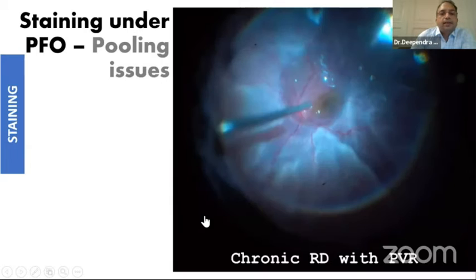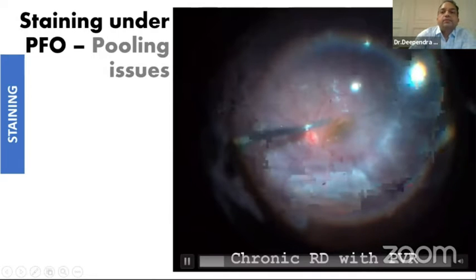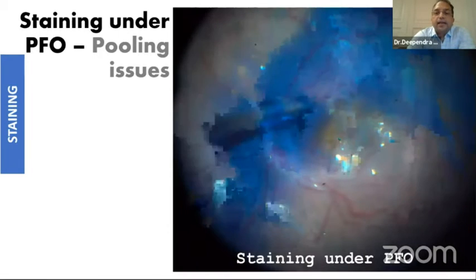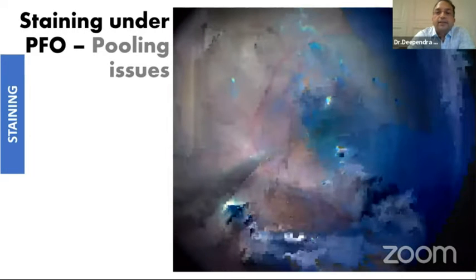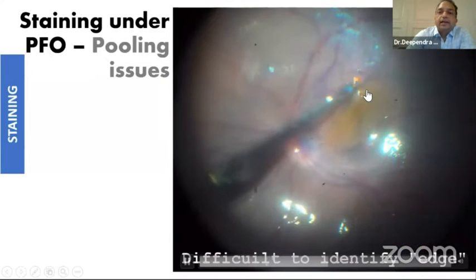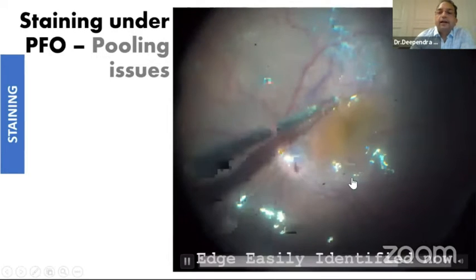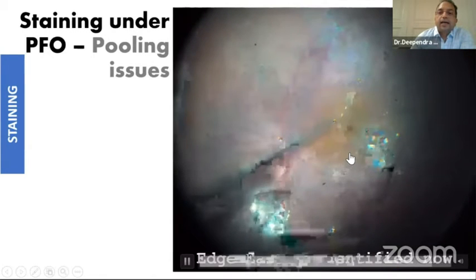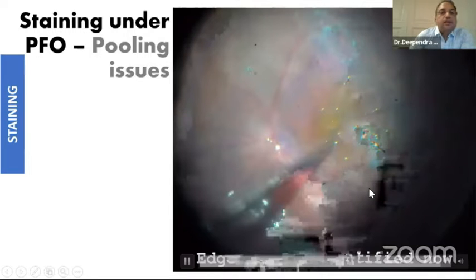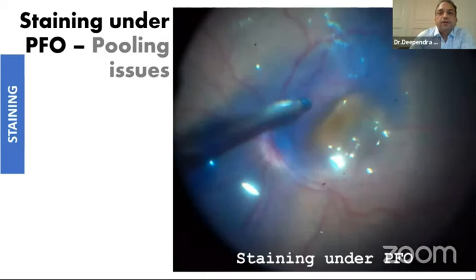For detached retina, we would stain under PFCL. The advantage of this dye is it works very well under PFCL — you can restain also under PFCL. Sometimes if there are retinal folds there can be some pooling, and this pooling may not allow you to identify the edge. What you can do is aspirate the excess dye and then you can easily find the edge of the ILM.